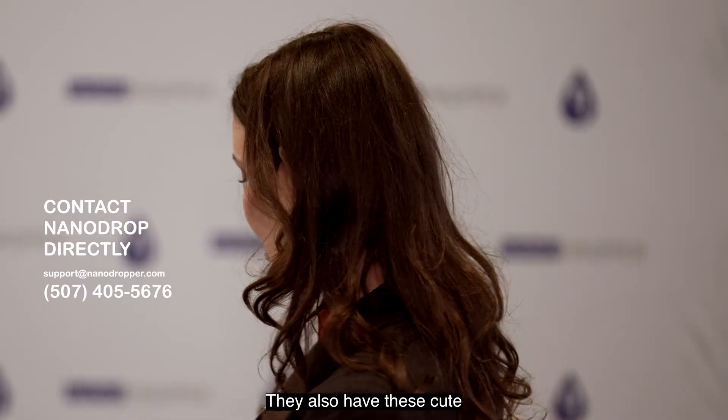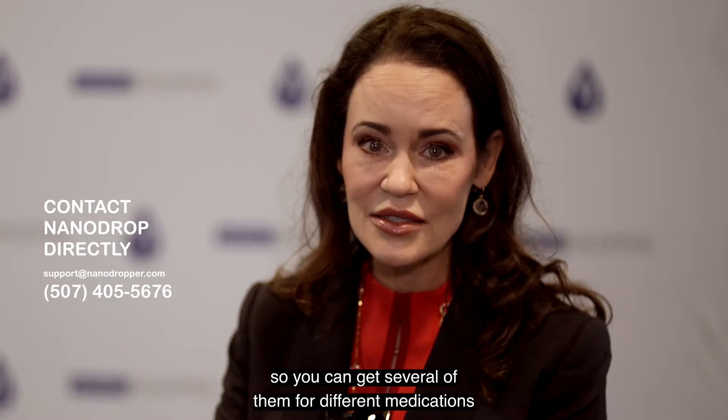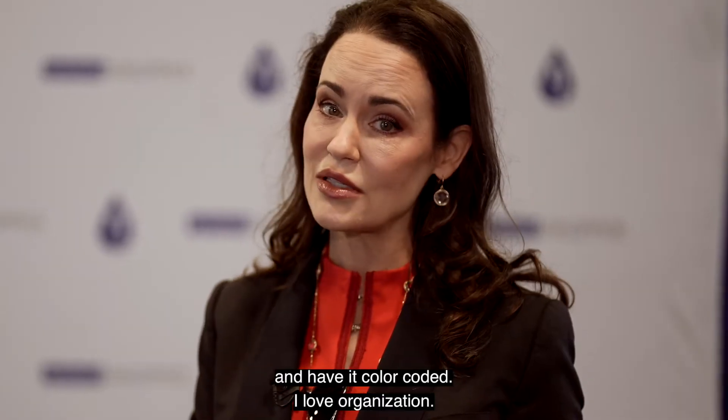They also have these cute multicolored stripes, so you can get several of them for different medications and have it color-coded. I love organization.